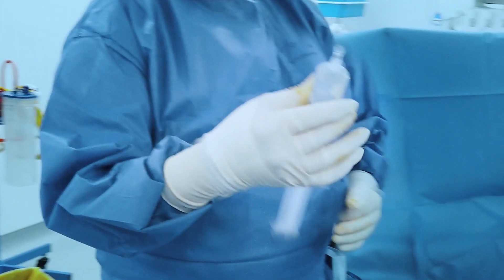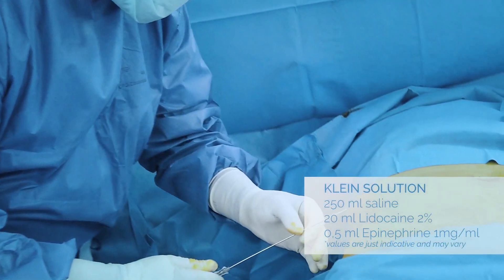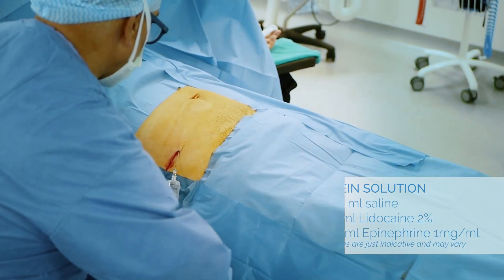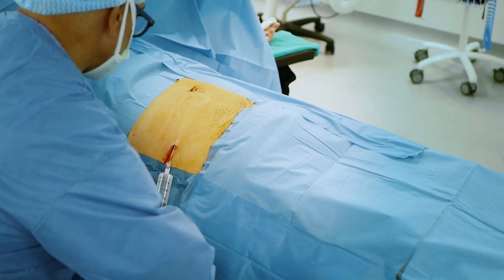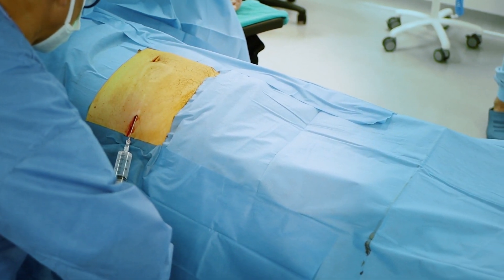Local anesthesia is done with Klein solution infiltration, which also helps vasoconstriction and tumescence. Use retrograde movements to move the cannula and distribute the solution homogeneously.